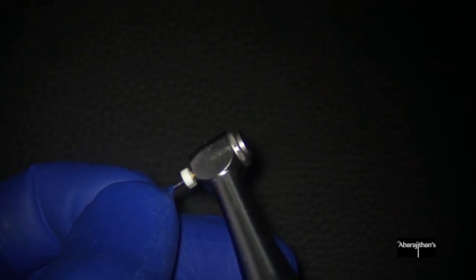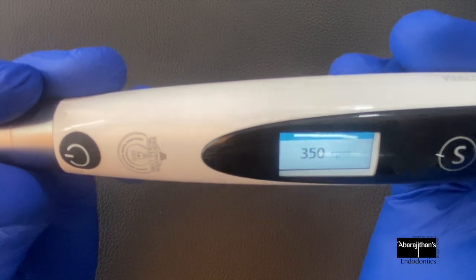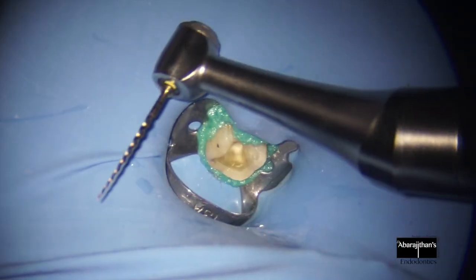When the file encounters resistance in the canal, the file not just stops — it starts reciprocating based on the angle that you have set. So there's an additional protection for files before it fractures.